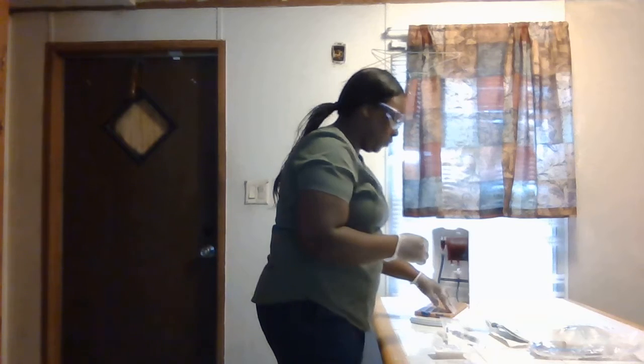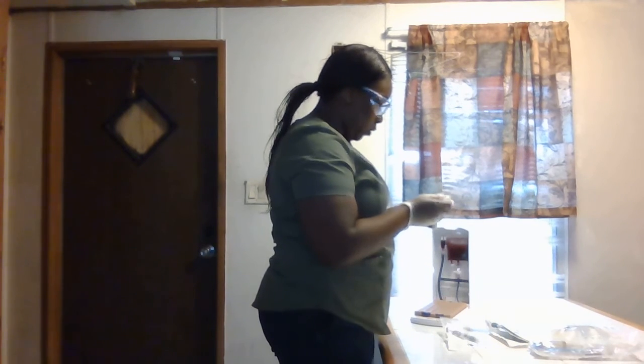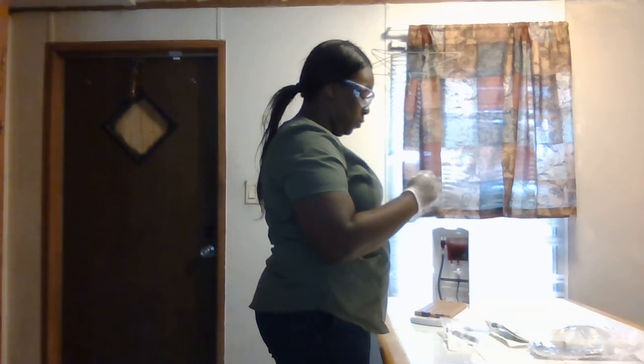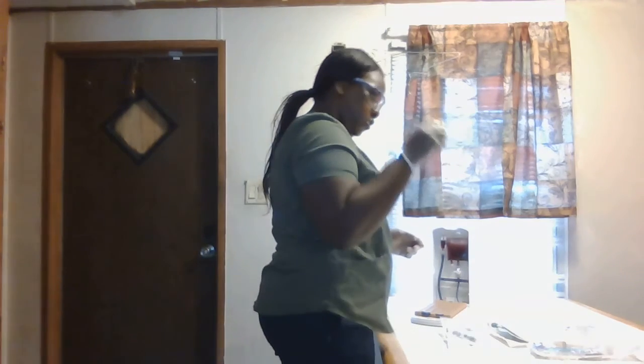So I can go ahead and put my tourniquet back on. Again, checking for that pulse. And we can go ahead and ChloraPrep the site. It's a 30-second scrub. Trash that. You listen for the click. The fluid builds up at the bottom. I dab a little bit, and then I'm going to scrub for 30 seconds.